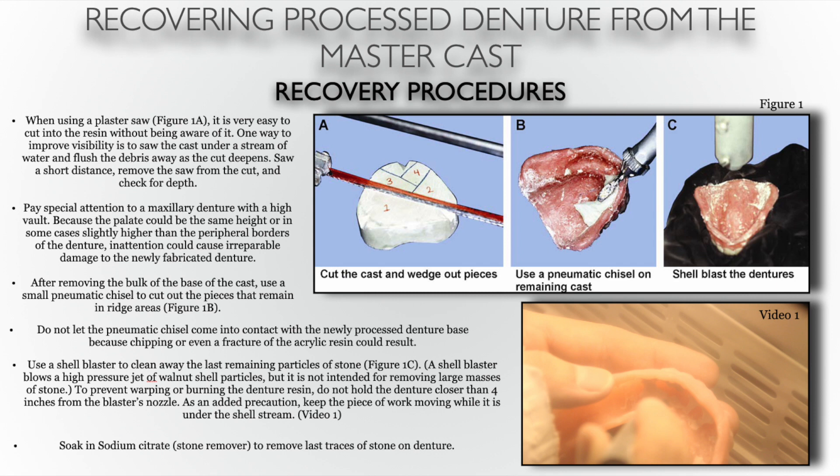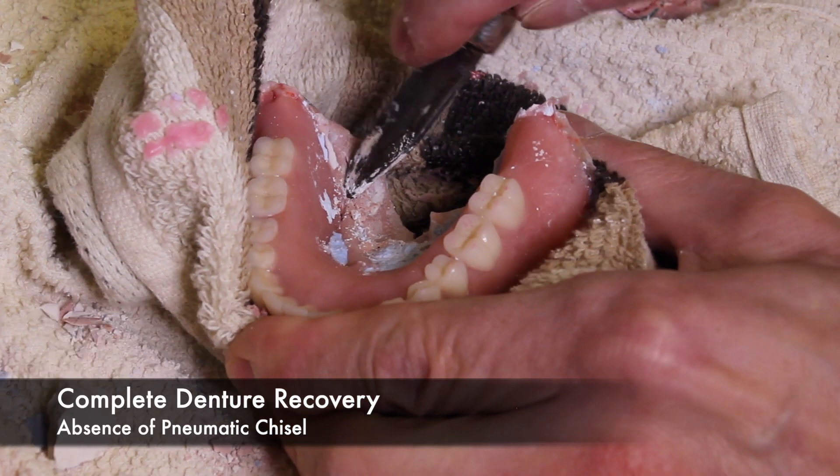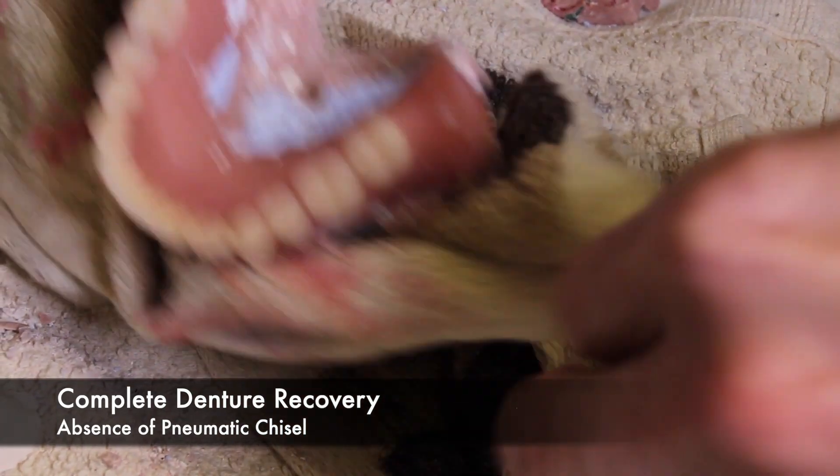The use of a sodium citrate solution can also be used to remove any remnants of stone left on the denture. Now, it is not always that we have all of this equipment available to us in order to recover the dentures from the models. In that scenario, many technicians just use a mallet and a knife. Although not ideal, in the absence of a pneumatic chisel, prying the denture from the model with a knife is the only solution.